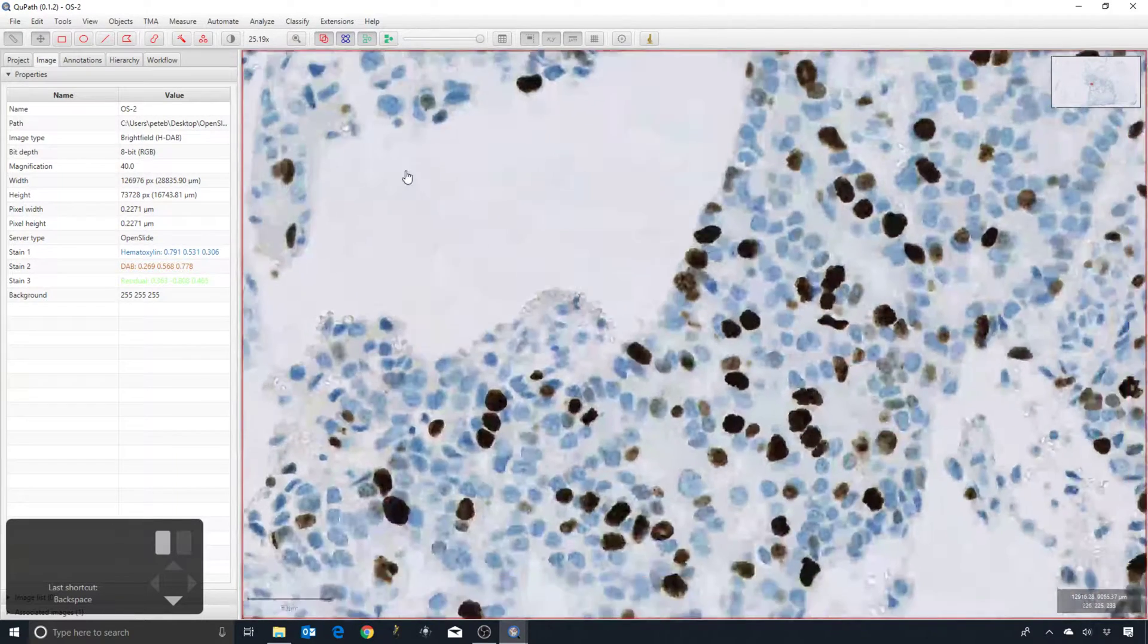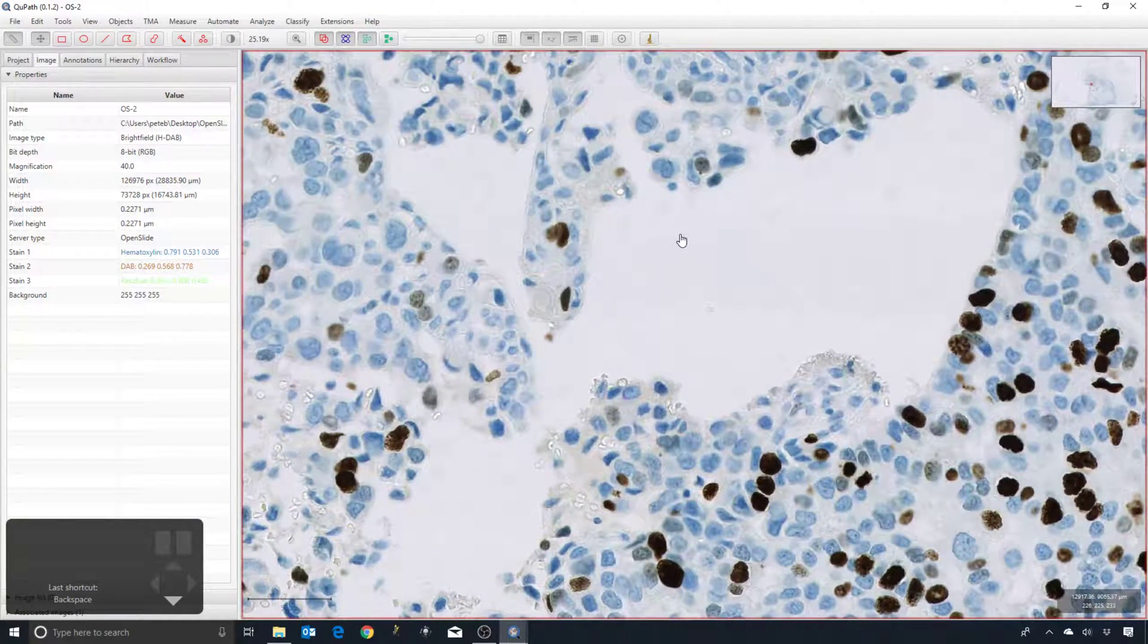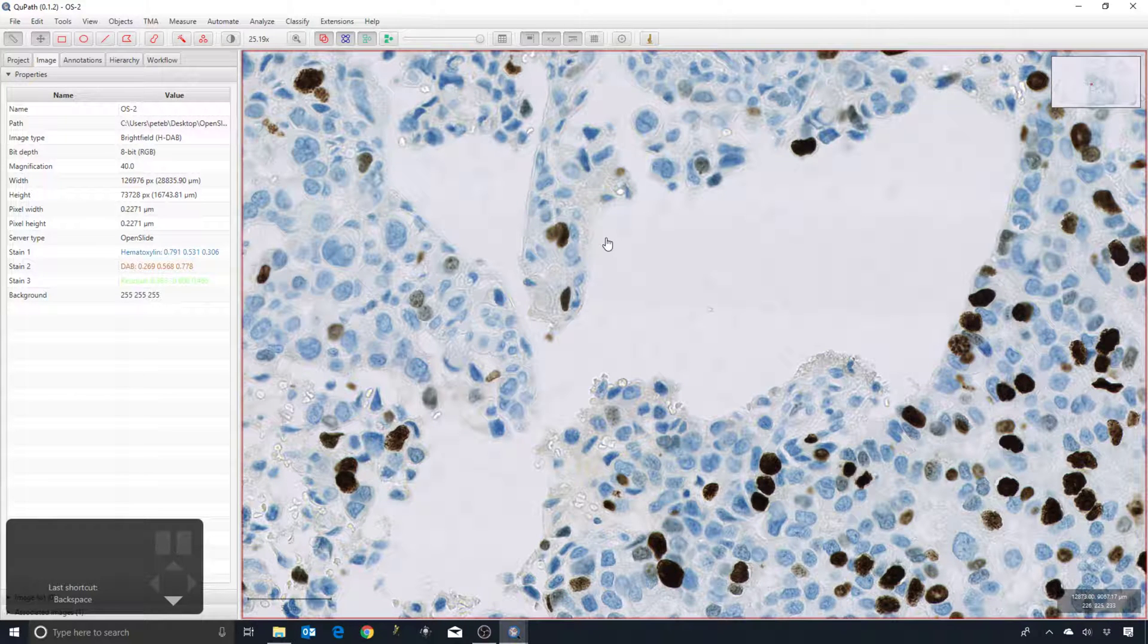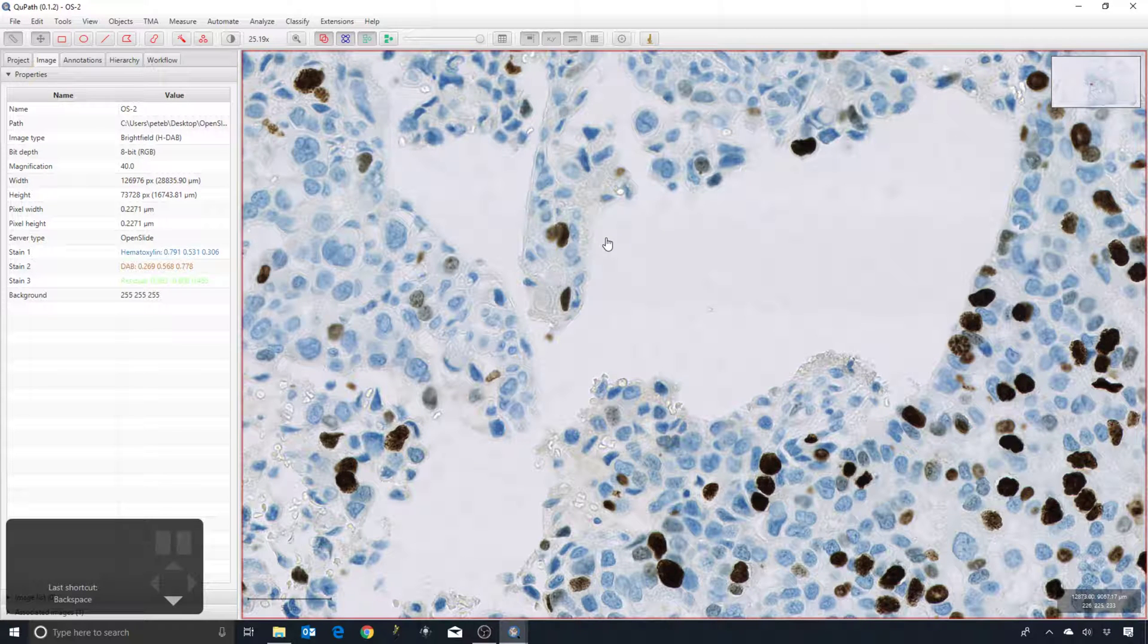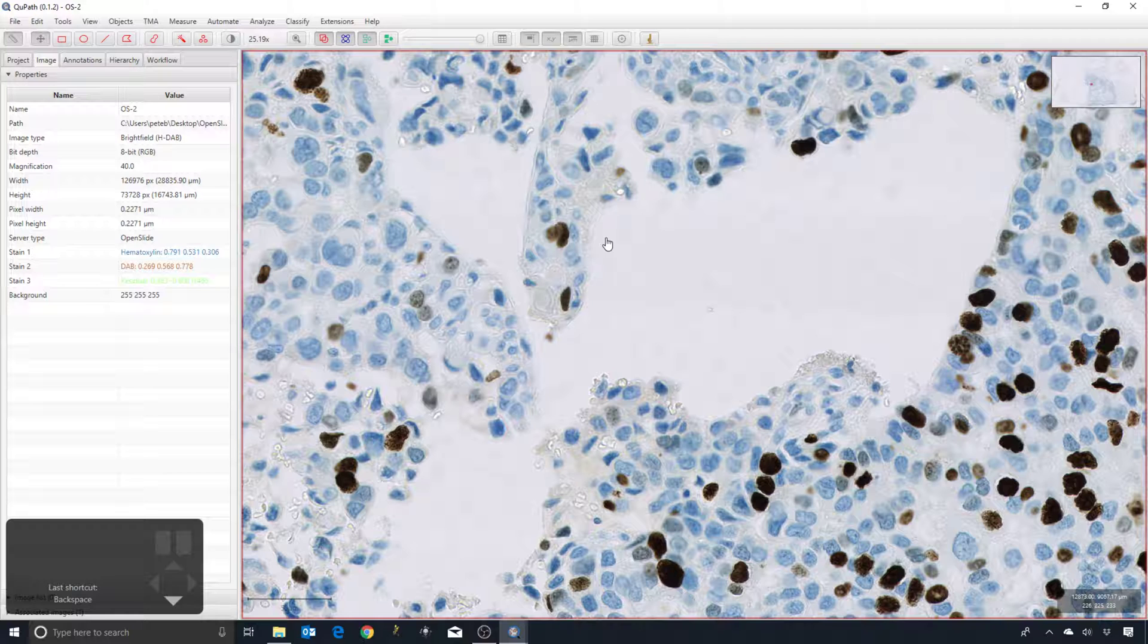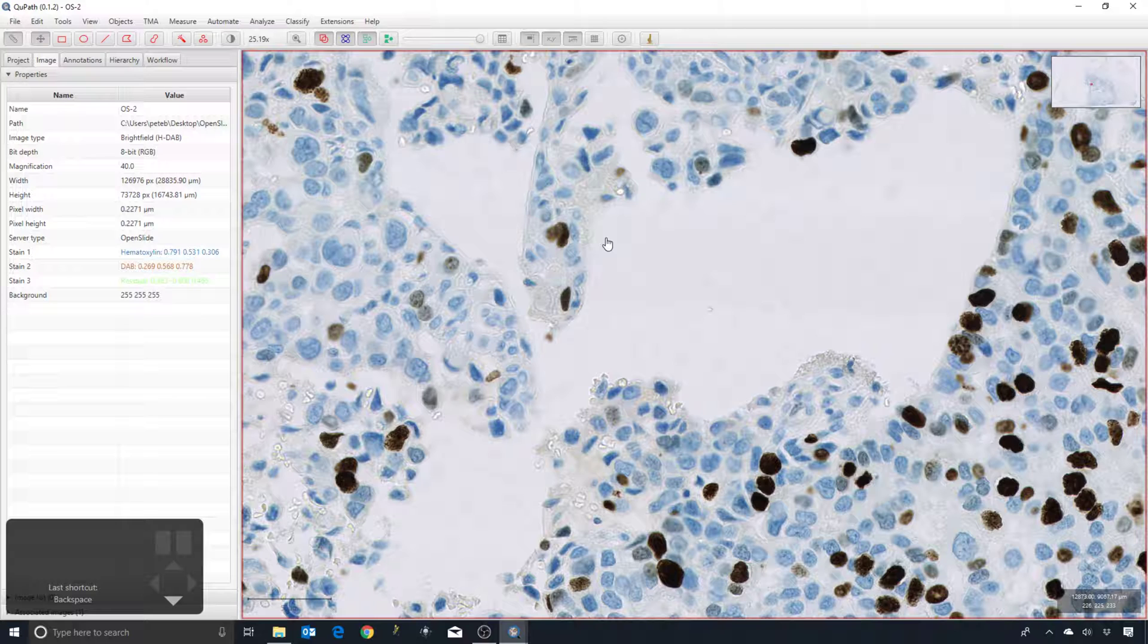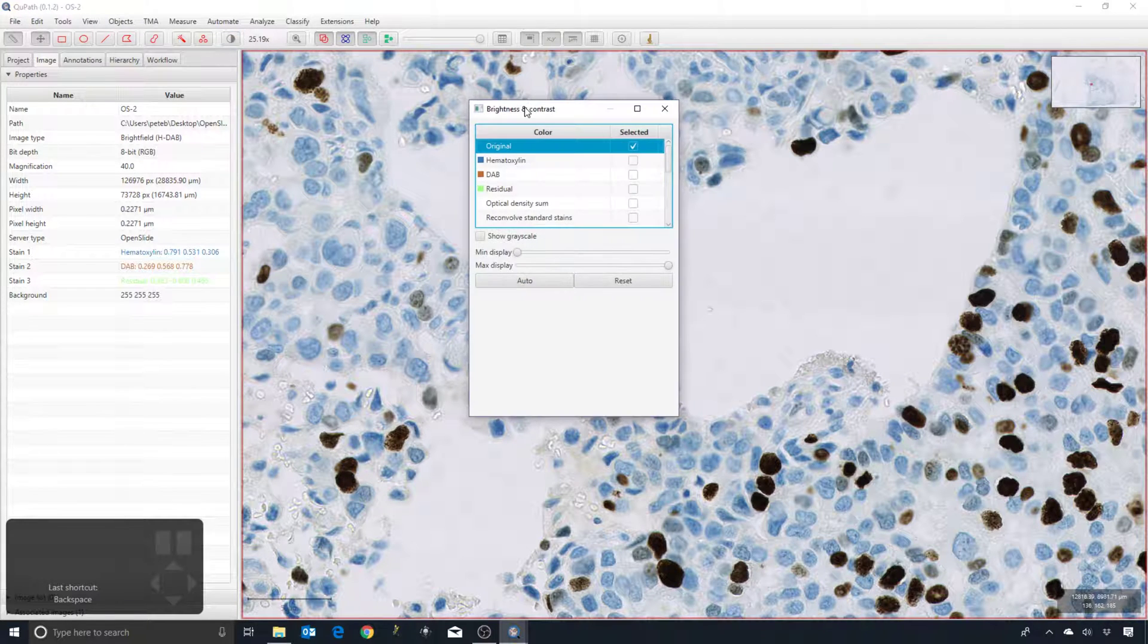Now I get a slightly different stain separation. What I can then do is I can try and find a brown region, and this can get a little bit tricky when you're trying an area that ideally would be only the dark staining and nothing else. It may be that there is no such region available. Actually, you should be using an image that only has one particular stain on it as opposed to a mixture of stains, and so we may not find any particularly good region.